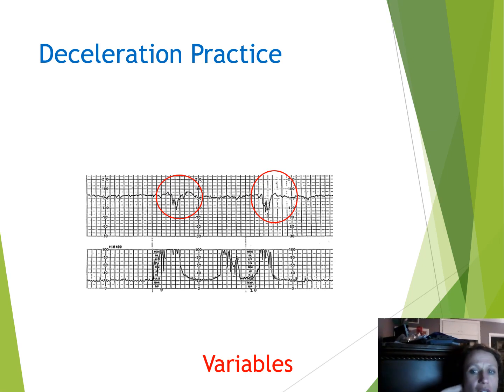Ultimately, if you cannot determine from the screen, sometimes on your computer screen it can be very difficult. You're really supposed to have the fetal paper strip. Actually, that is what they teach in fetal monitoring classes. You're supposed to only really be evaluating it off the paper strip, but most people do not do that.